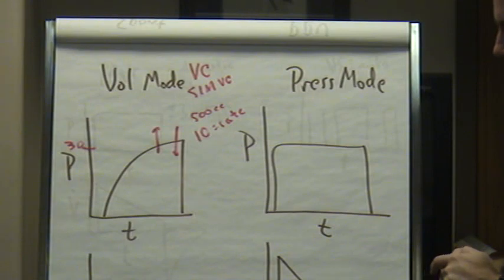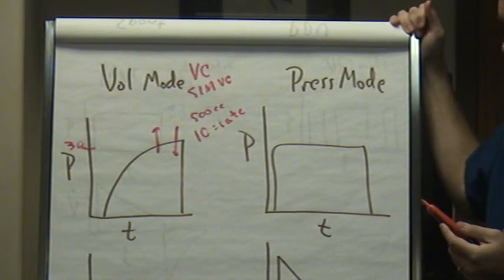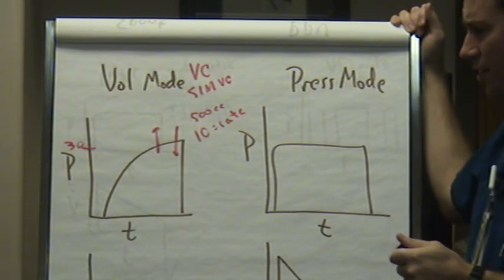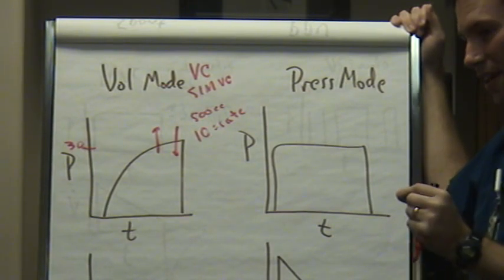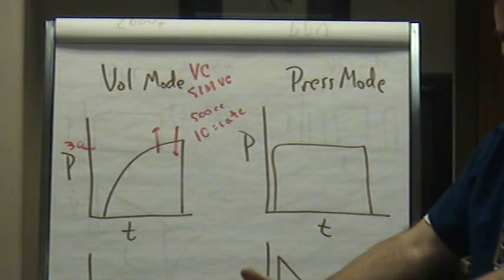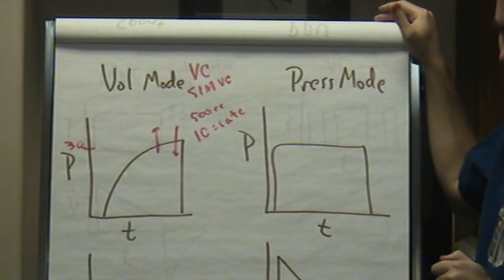So we know that your peak pressures are getting high. And we want to stay at this hospital less than 30 on all our pressures on all our patients. There's literature out there showing that even at a 30 of pressure at the vent, some of those small airways are experiencing up to 120 centimeters of water pressure to open them up. So remember, 30 is average. That's what makes its way all the way back to the ventilator through the tubing. And so that's why we keep it 30 or less.